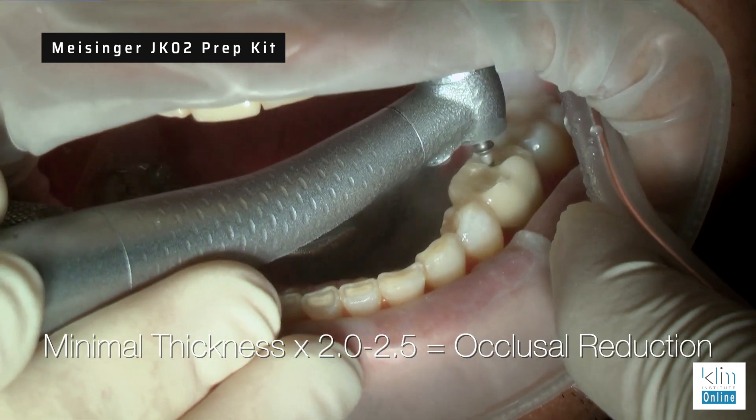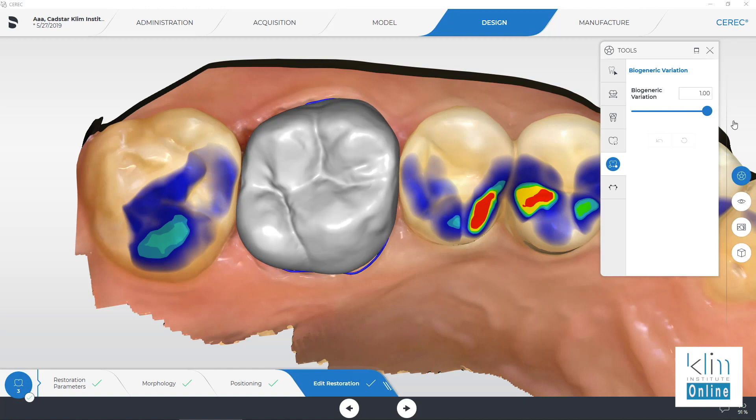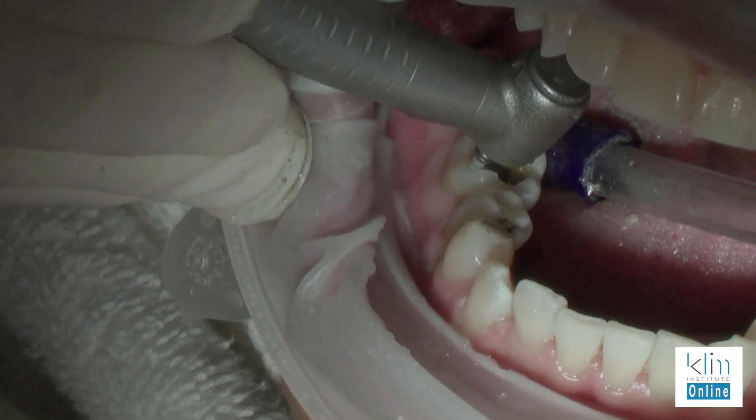I always use two to two and a half times the minimal thickness in my occlusal reduction. I've been doing that for years, even with gold — I would reduce at least two millimeters so the gold wouldn't wear through. And guess what happened after 30 years? Some of that gold started wearing through, so I had to upgrade those crowns. We need to look at the minimal thickness and prepare so the biogeneric variation proposal — which I prefer posteriorly — can optimize the morphological presentation on your screen. That's how you start. It's all about the prep and reduction. And I'm sending fewer teeth off for root canals now than ever in my 30-plus year career.